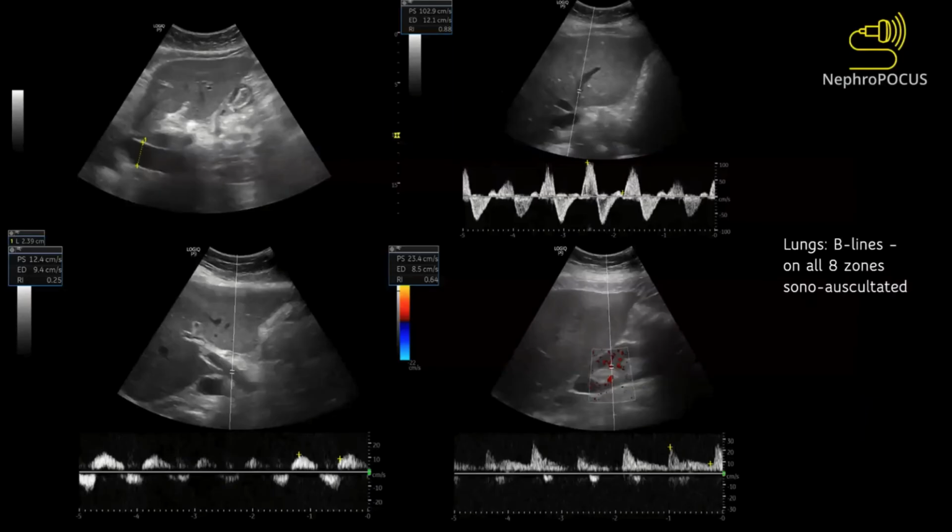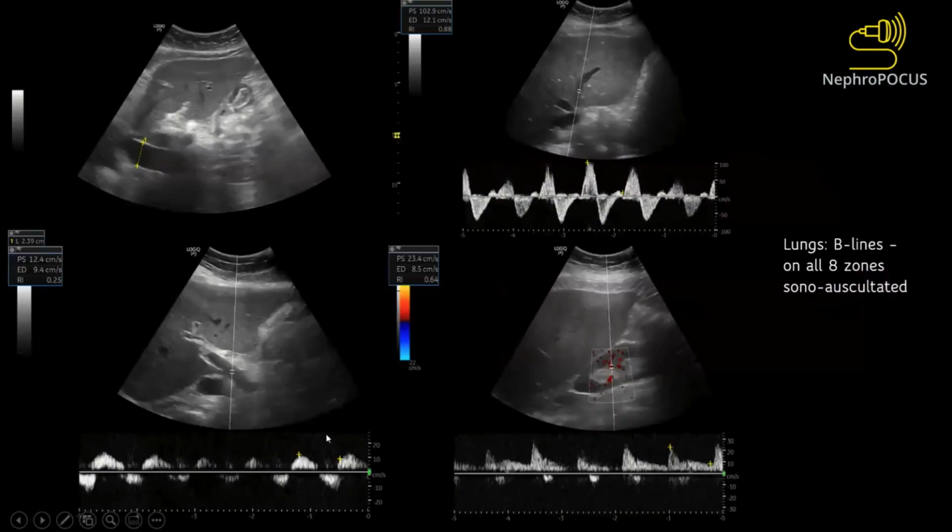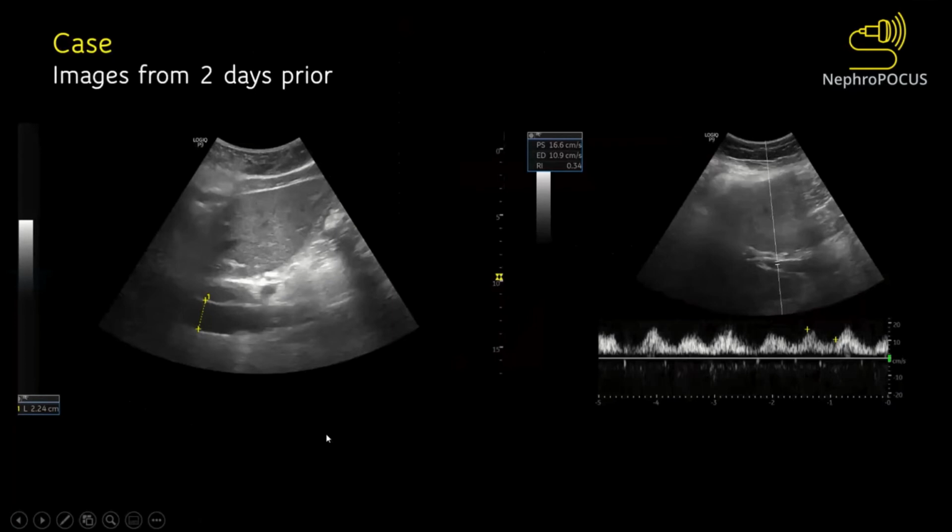On the day of discharge, I did this ultrasound. It shows a big IVC. It's not clipped, but it was relatively plethoric. And hepatic vein, I did not have EKG that day, but still, you can see it is most likely a D-only pattern. And portal vein, you see this 100% pulsatility with systolic flow reversal, exactly like you saw in the previous patient. And renal was monophasic D-only or diastolic-only flow. That is severe congestion. I scanned her like 2 days ago, and the IVC was similar, big, but the portal vein was like this. So there was no significant systolic reversal, and it seems to be less pulsatile compared to this one. So definitely the congestion has worsened despite the patient feeling fine and everything.